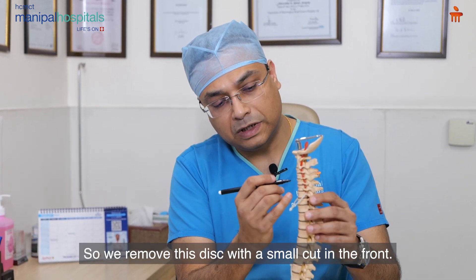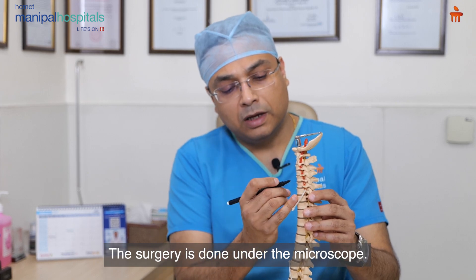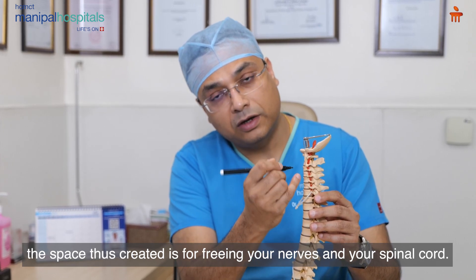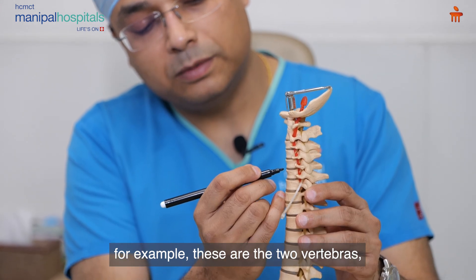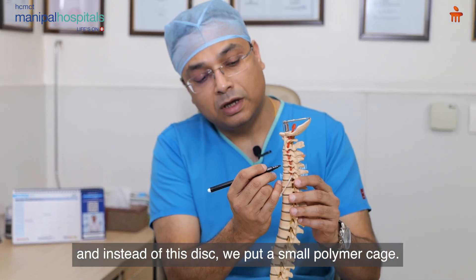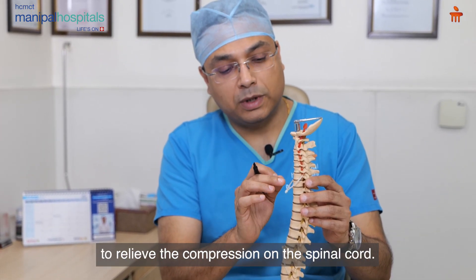We remove this disc with a small cut in the front. The surgery is done under a microscope. Once we reach there, we remove the disc — the space thus created frees your nerves and spinal cord. For example, with these two vertebras affected, we remove the disc under microscope and instead put a small polymer cage. If required, a small plate is put here to relieve the compression on the spinal cord.